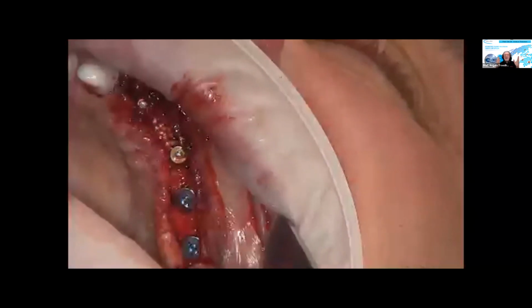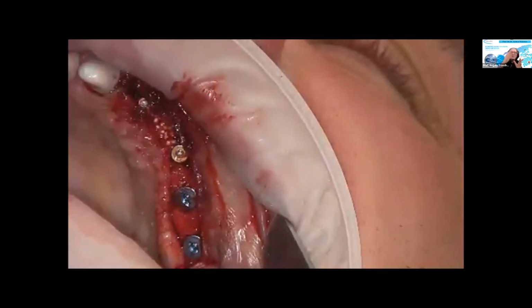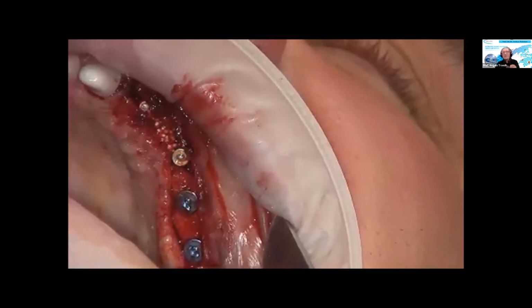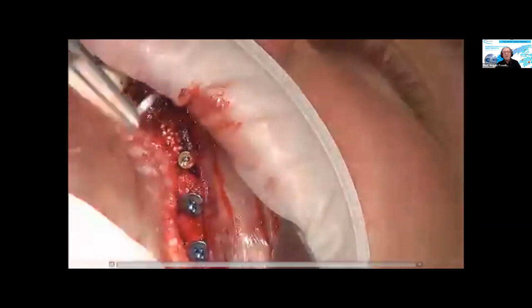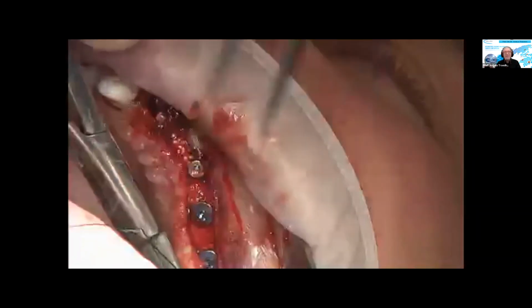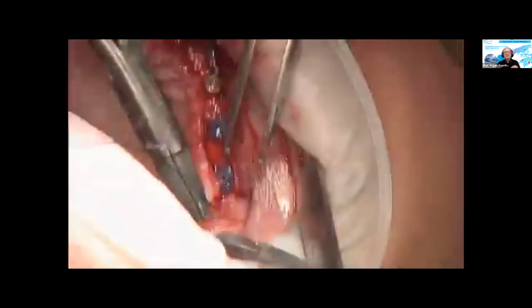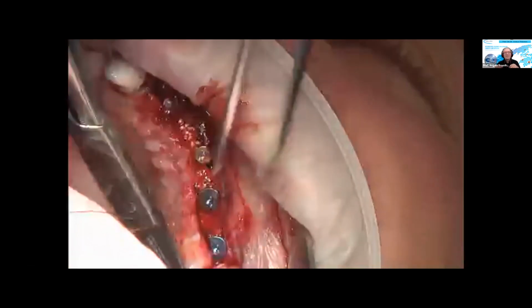And that's the secret behind it. So you just do an autologous connective tissue transplant simulation. Of course, you can use these connective tissue transplants also to cover this area here, which would make sense because we use it to cover areas. In this case, it wasn't necessary, so we just step over to doing the suturing.